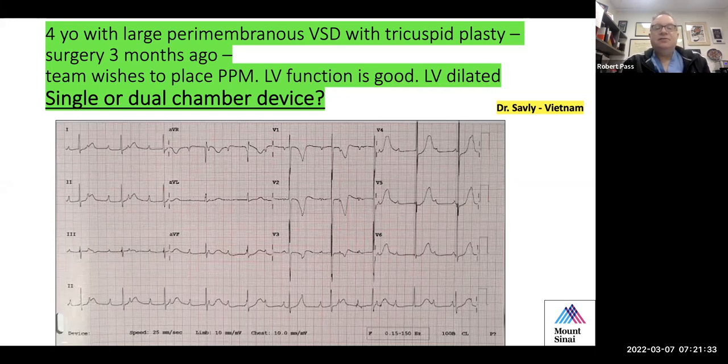The reason for that is because they really only had these so-called screw-in electrode leads, which were basically unipolar leads and, unfortunately, were associated with a very high incidence of high thresholds and so-called exit block. So it was very, very common in that time period to put in just single chamber devices, a ventricular pacemaker. It turns out that patients did very well.